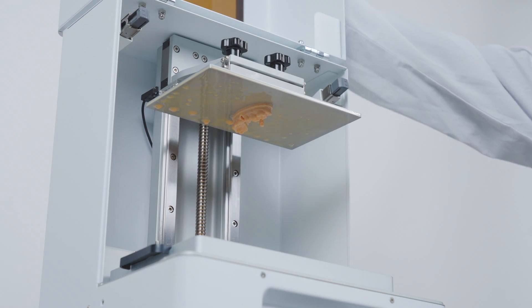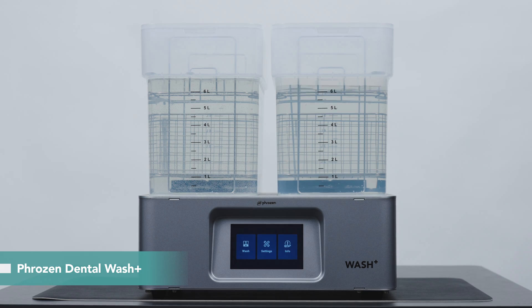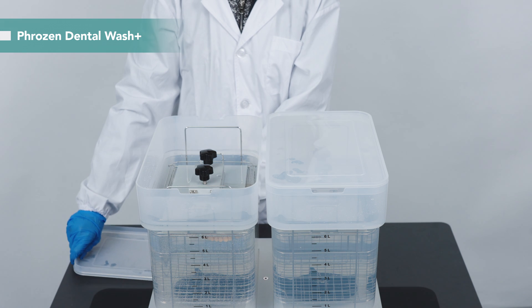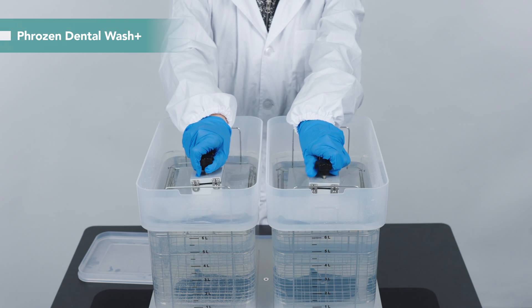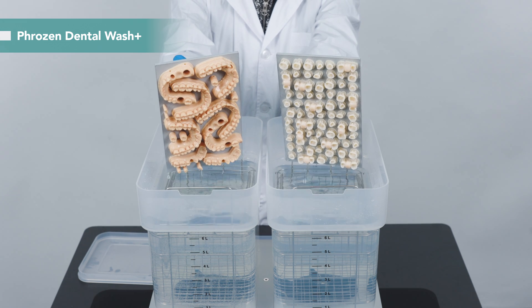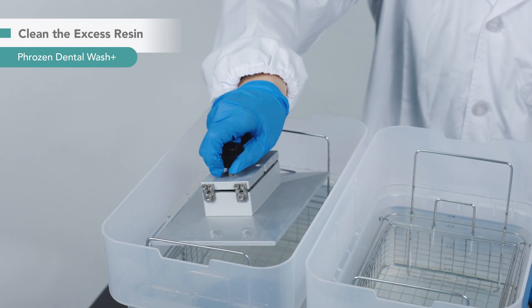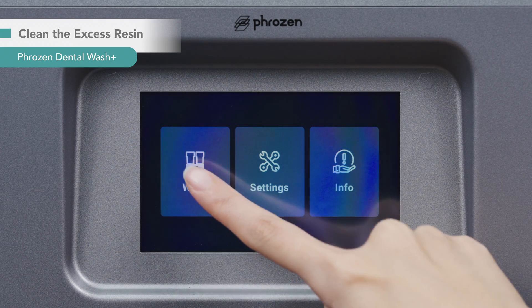After 31 minutes, the print is complete. We are going to wash the model with Frozen Dental Wash Plus. Equipped with a versatile dual tank system, it is designed for dental professionals to fulfill various washing requirements. You can set it to double your wash output or finish two different washing requirements at the same time. In this case, we can wash our printed removable die model and crown in a single cleaning cycle. Fill the tank with water, place the building plate directly into the tank, and set the washing time for 5 minutes.